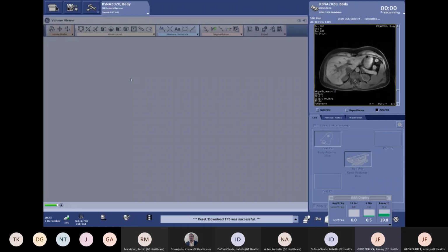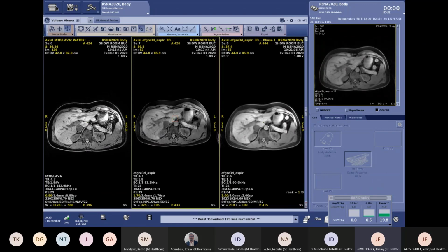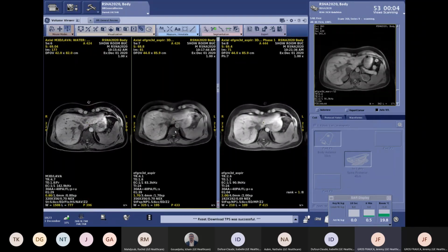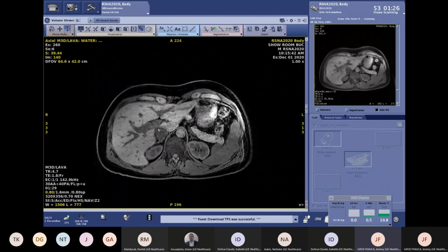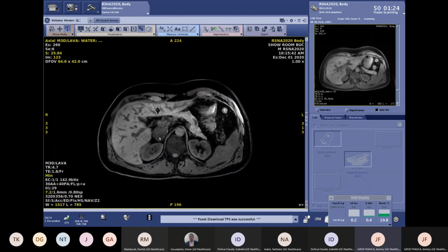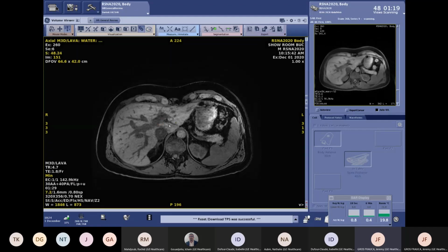In the meantime, if I may add something, Jeremy, it's also not necessary to select the coil. The system detects the coil automatically, as you can see at the right side corner of your screen. And you don't need to manage how to position the coil. You just need to manage how to put the coil on the patient. And remember, this coil is very light, so it will be very useful for your patients who have pain as well. I'll let Jeremy continue the presentation.